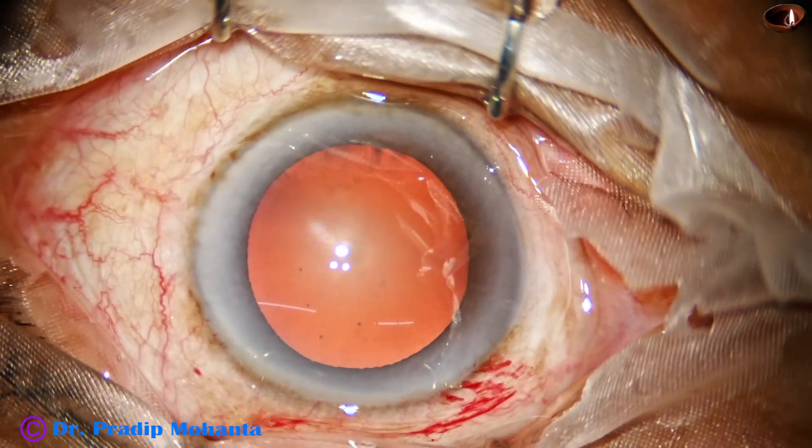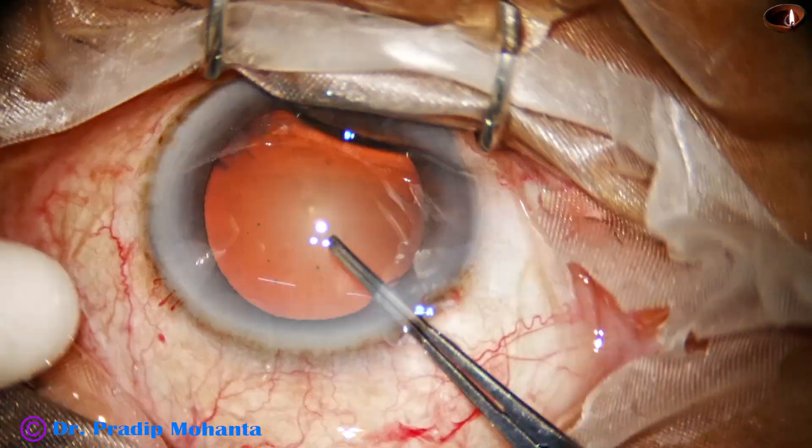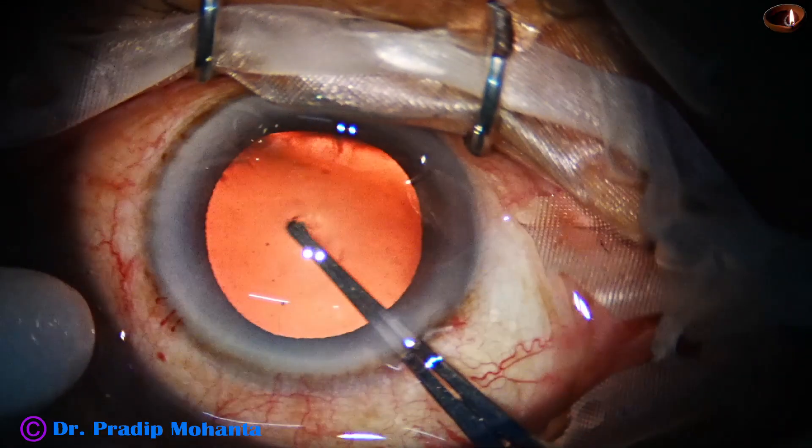And now, capsulorhexis. Capsulorhexis is done with this instrument. This is a utrata forceps.